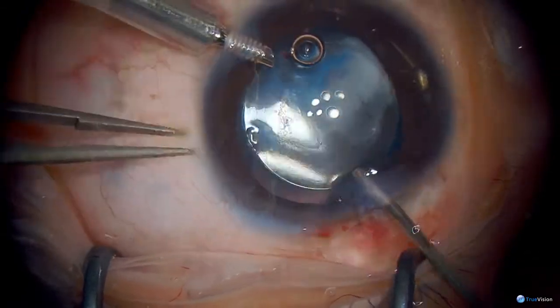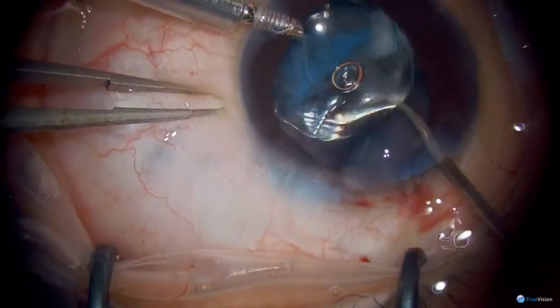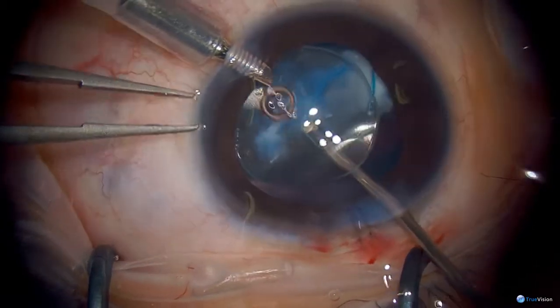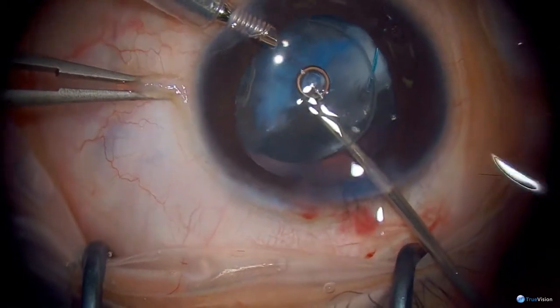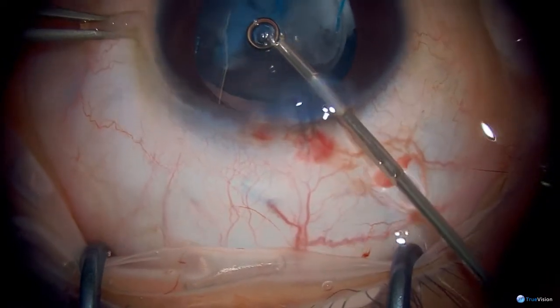So now we're going to open the posterior capsule and do a vitrectomy and also remove that membrane as much as possible. So I'm making sure my cutter is on. And I want to go underneath the IOL. Now I've already made that opening there, you can see.